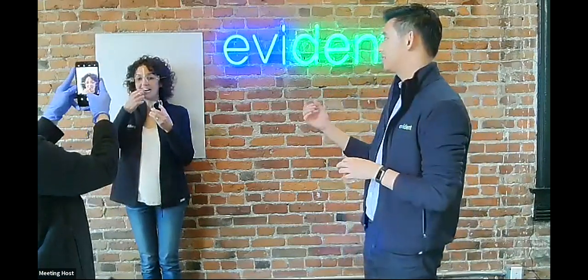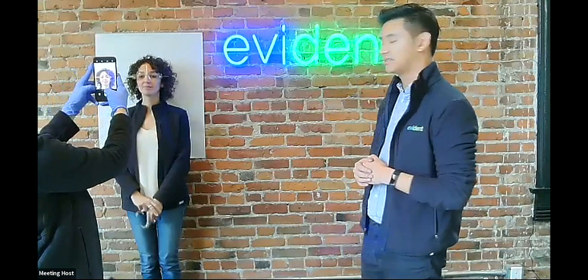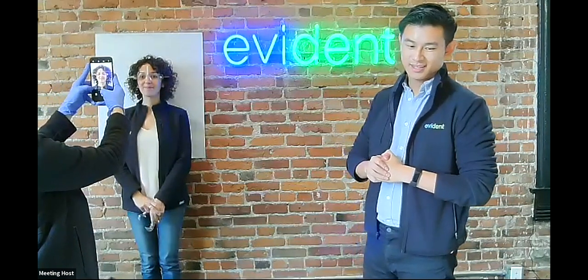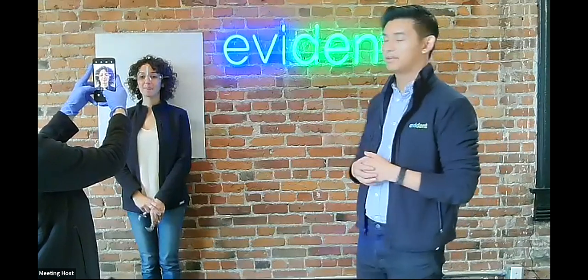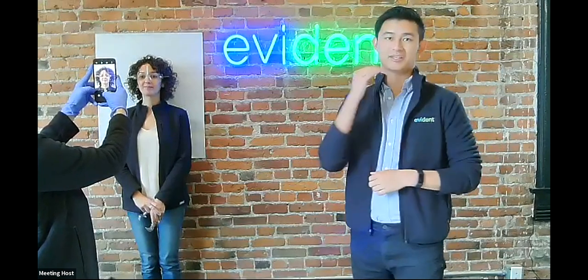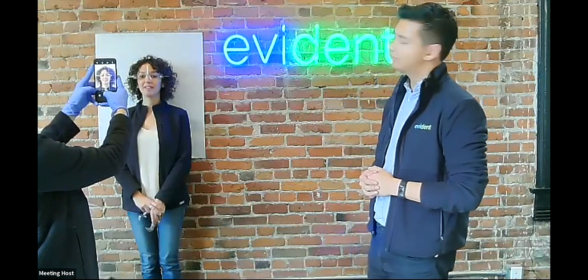And then the second photo is the repose. So she's going to take out the retractor as well as the mouthpiece, the cotton roll. And so for the repose, what we usually say is we get the patient to say the word or name Emma, and then hold the mouth position at Ma. What this does is the lips are in a relaxed position. Emma.